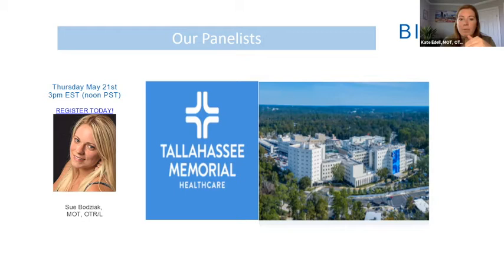Yeah, I love your example of finding that just right challenge where I can modify it or grade the activity, even the evaluation. And I'll ask Sheree to jump in here and give a little more detail about the difference between those two circles that you're referencing. Those are really great points. Sheree, do you want to jump on?